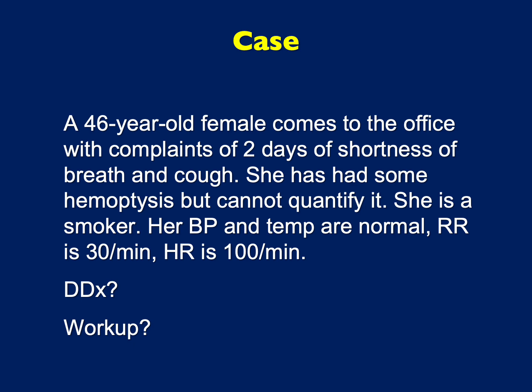So as you think about this case, try to come up with a differential diagnosis and start thinking about how you would work up this patient. I would suggest you pause the slides here and write up a differential diagnosis and some workup before we proceed.